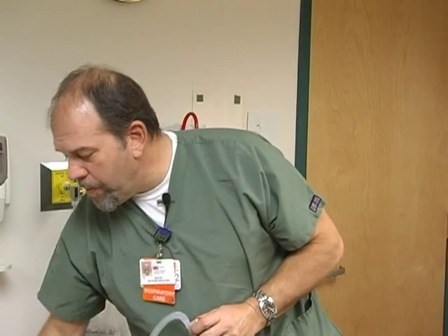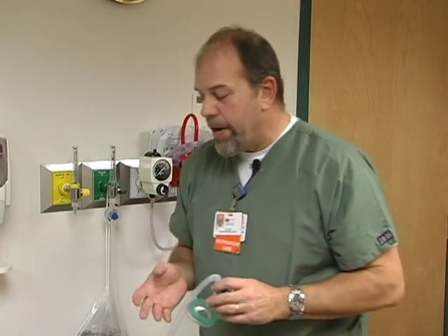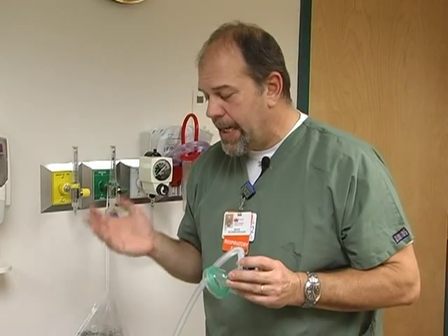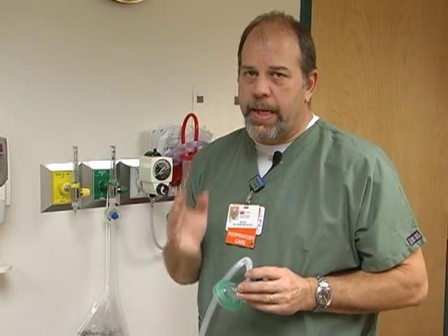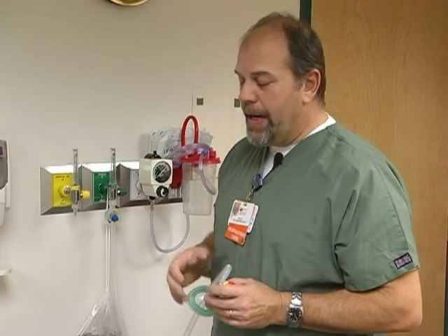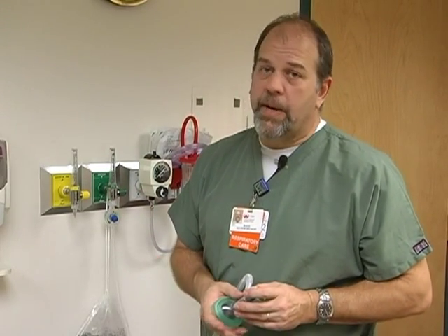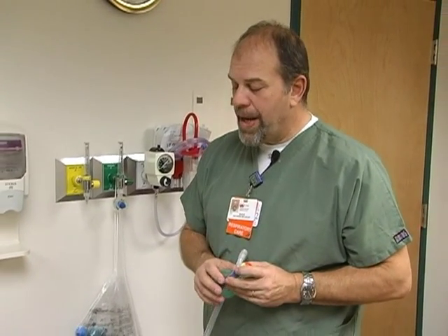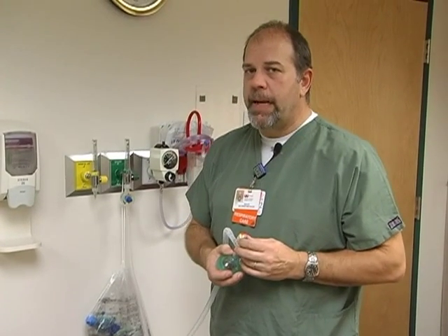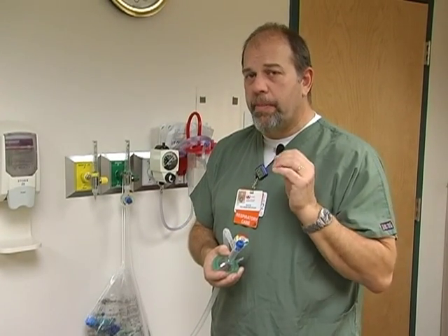One thing to remember: the approximate PEEP value at 5 liters is 2 — we're not going to use 5 liters. At 8 liters it's 6 — we're not going to use 8 liters either. We want to use at least 10 liters, which gives us up to 9 centimeters of PEEP. If we go to 15 liters per minute, that gives us around 15 centimeters of PEEP if we need that high. We're going to start with a minimum of 10.